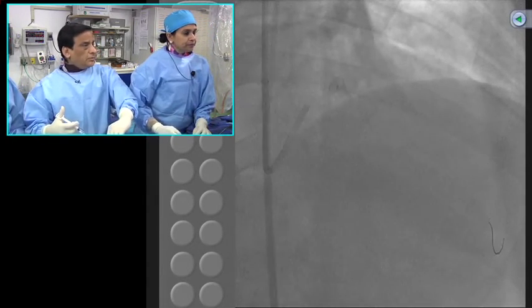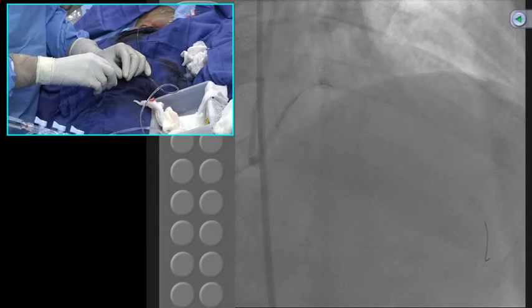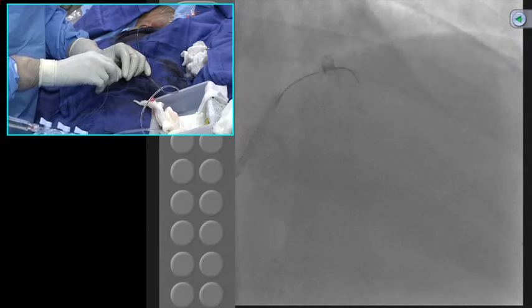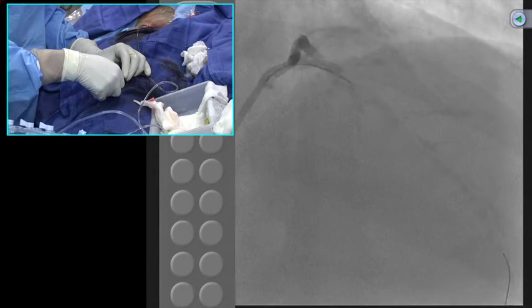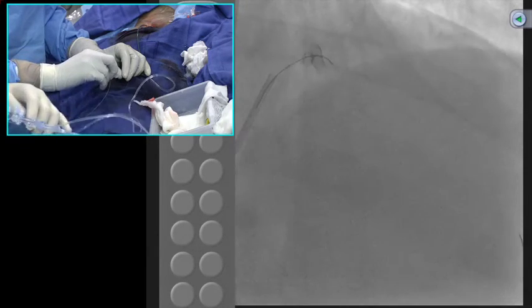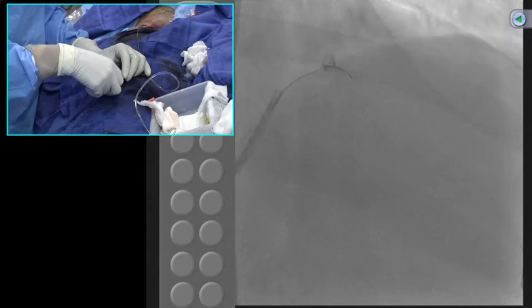But most of them were no stenosis, no? No, the trial we did was without stenosis, yeah. But I think we have an algorithm for how to handle this side branch. Look, even without discussing the results, I think viewers, if they have been watching enough, have a pretty good sense of the algorithm.